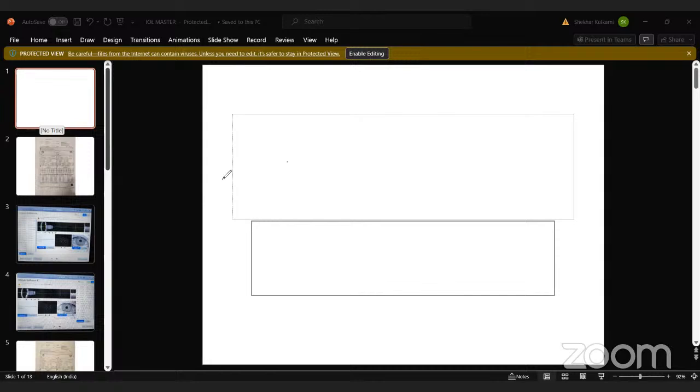The other thing is the corneal surface should be regular. Regular means the contact of the tear film and the cornea should be maintained. So we have to tell the patient to blink frequently during measurement. And if there is a previous dry eye, it should be treated. Dry eye treatment is very important. If you want to use any lubricating eye drops, it should be half an hour to 1 hour prior to the measurement.